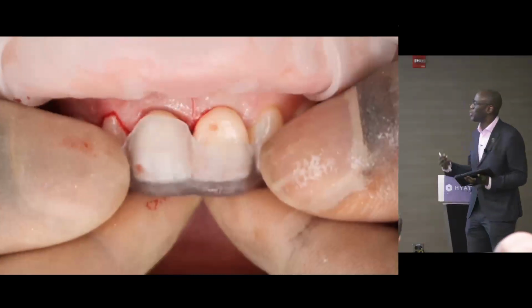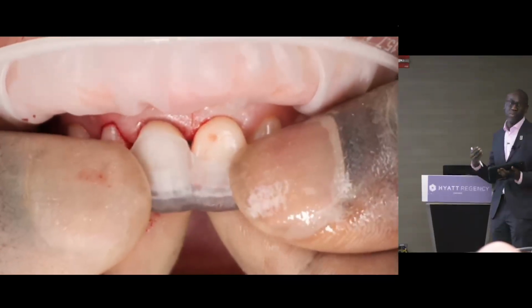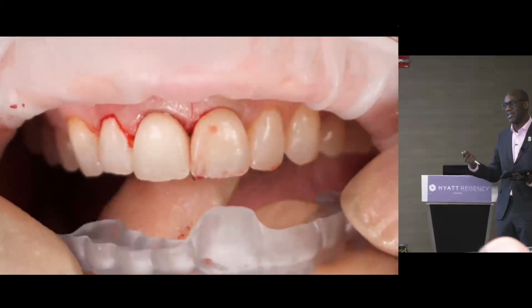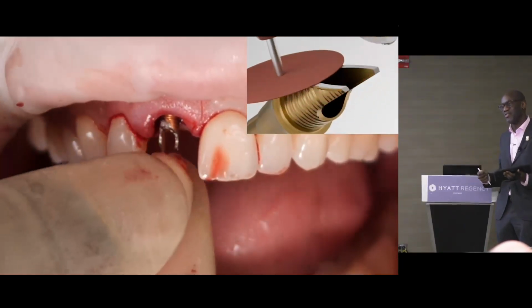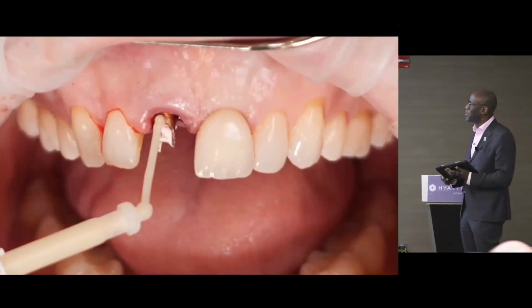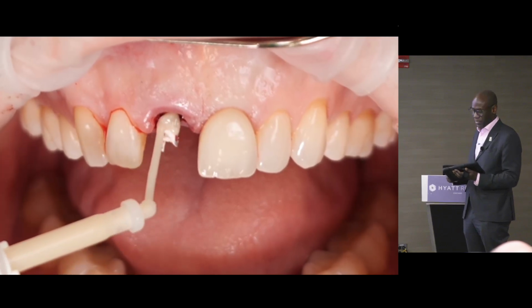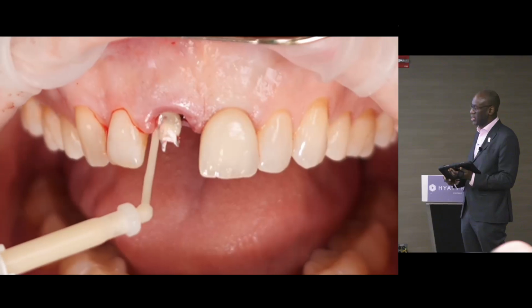So we've been able to think about this, get this all ready, so when it comes to placing the implant, and then afterwards doing this part where I'm using the old crown to pick everything up, we know what we need in the cupboard. So it means that our pack that arrives from the lab is a guide, a hybrid base G. Sometimes if Steve is kind enough, he'll cut it for me, but most of the time he doesn't. He lets me do that work on my own. And you can see here how we just do a very simple pickup that you'll see in a second.